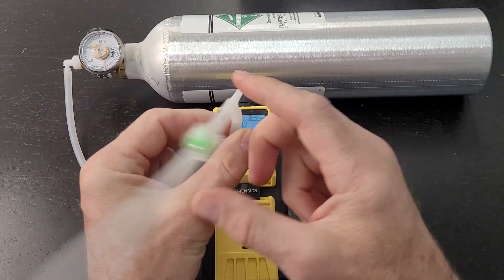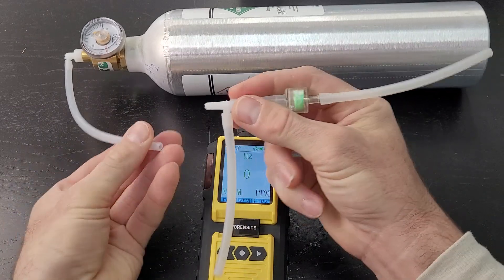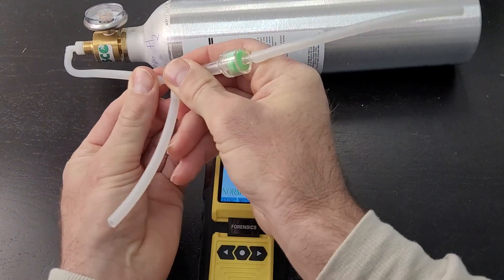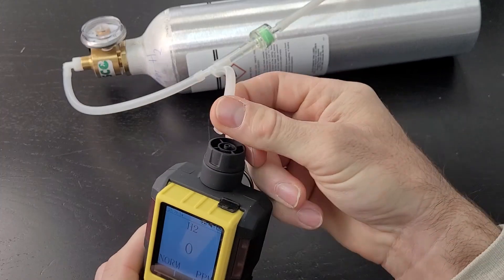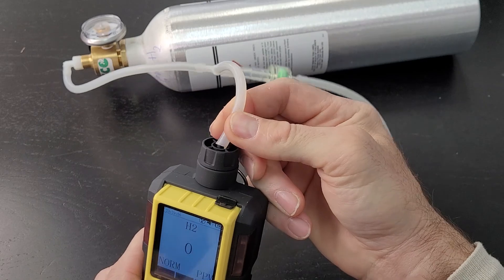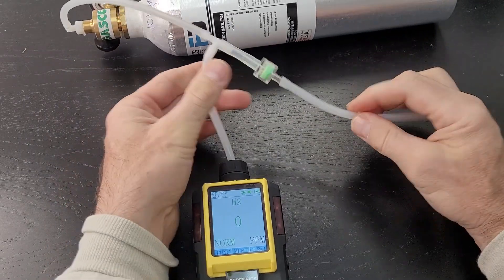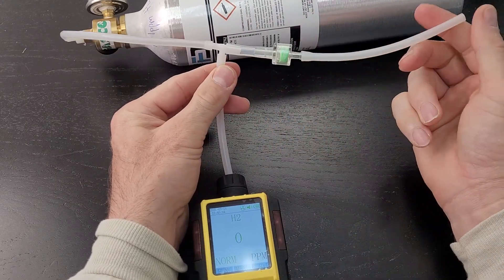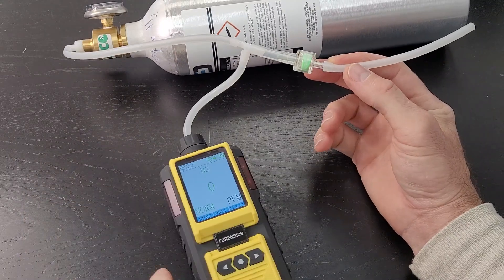So the way this works is we pop in our gas supply on one end of the T-piece, right over here. The middle part we feed into the analyzer, pop it into the barb, and that's it. The filter, which is a small particle filter, goes to the ambient. This micro pump continues to draw.